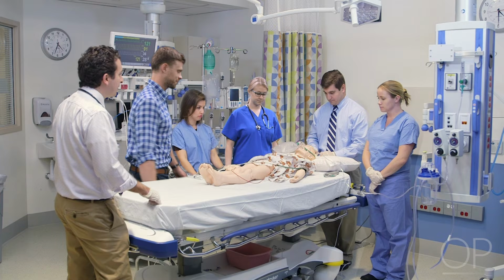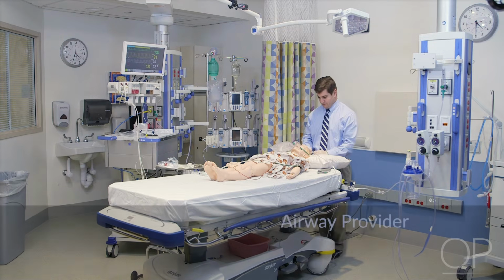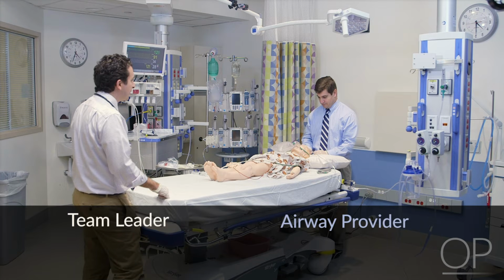Ensuring the appropriate personnel are present for the procedure is critical. The intubation team members may include airway provider who performs the intubation procedure, team leader. It is ideal to identify a team leader separate from the airway provider. However, depending upon the situation, this may not always be feasible.